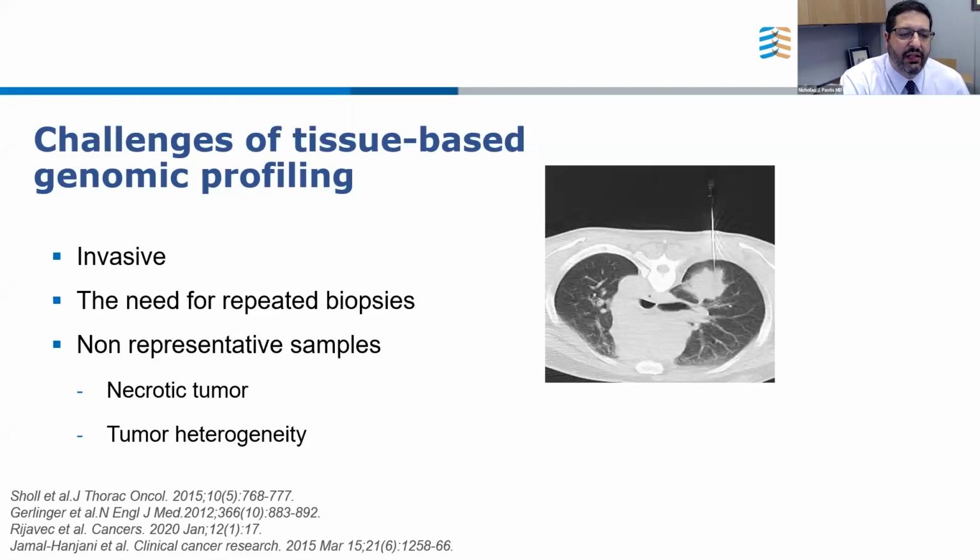That's a potential challenge. And then some of it is operator, people that have done thousands of EBUS versus people that have done 40, et cetera. It's not all numbers based, but there's some feel, some amount of speed that you may have, so you may cause less bleeding in your sample. So there's operator factors, and there's bleeding that can make your sample difficult to interpret. The big one is necrotic tumor. I mentioned that big liver lesion in the early slide. It looks like a tempting area to biopsy. A lot of times you get dead cells and there's not DNA for molecular testing, unfortunately.